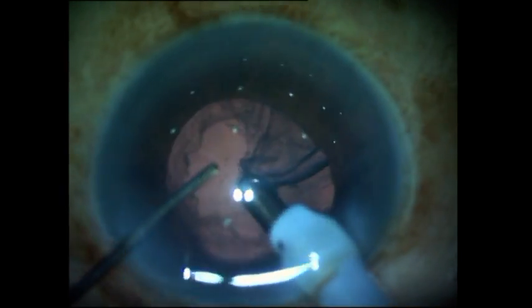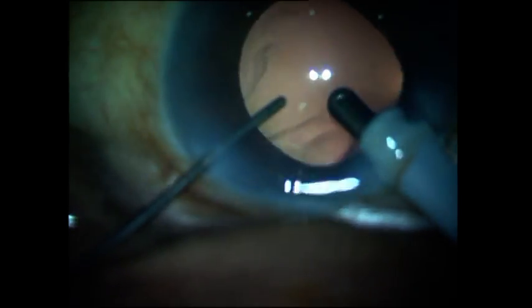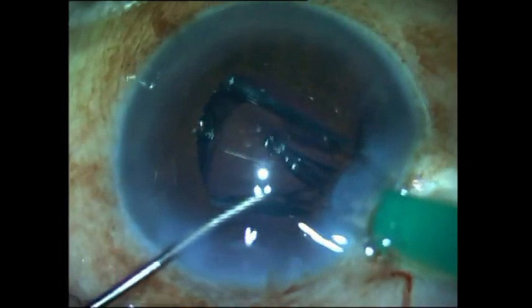Cortex aspiration is finally performed, and every time you come out with the phaco probe or the IA probe you should make sure that you inject viscoelastic and avoid the sudden shallowing of the anterior chamber, which could cause the posterior capsule to rupture.